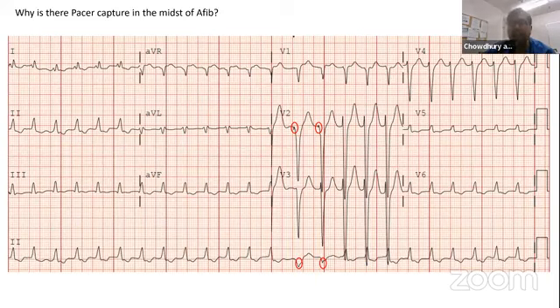I tell the residents, particularly the residents, find out: is the EKG sinus rhythm or not sinus rhythm? If you see the P wave, tachycardia or bradycardia, wide complex or narrow complex? Go with the simple, and does it have a pattern? Is it a bundle pattern or not? So I think sometimes we need to make it easy and then explain. If you jump into trying to explain, then you lose the obvious things, and it feels intimidating for the residents. So I told them, look at this EKG: tachycardia, yes.